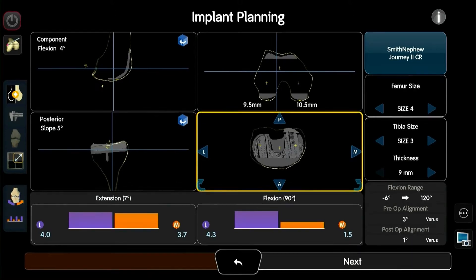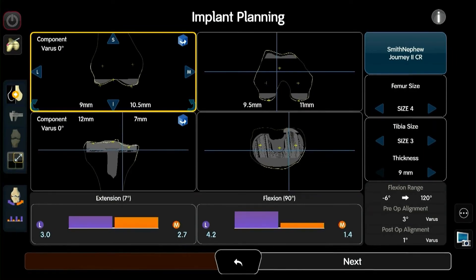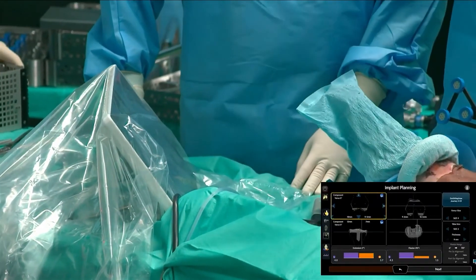So what I'll do here is go into the femur and distalize. Bringing the femur down shortens the extension gap — now I've got 3 millimeters lateral and 2.7 medial. Can you show that again? Go up and down. So now we can see in the left-hand corner — there's an 11.5 cut at the moment.